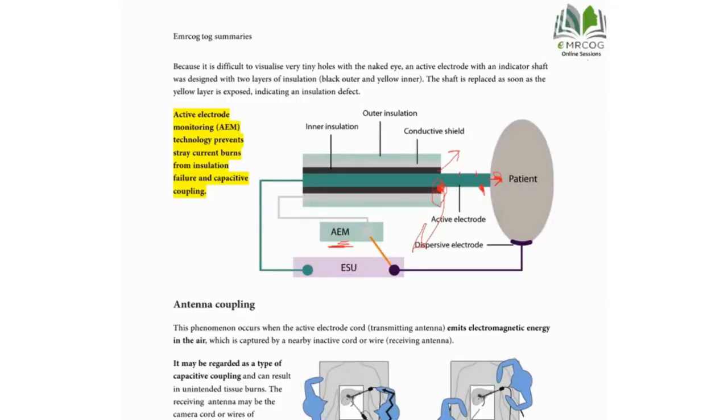Okay, again, what is the difference between insulation failure and capacitive coupling, because both of them are going to give me the same result. I'm having an injury in a nearby organ, right? So you can detect it if the insulation failure is big, or if it's near the working area you are dealing with. If it's far from the place you are working with, it will be very difficult to distinguish between them.